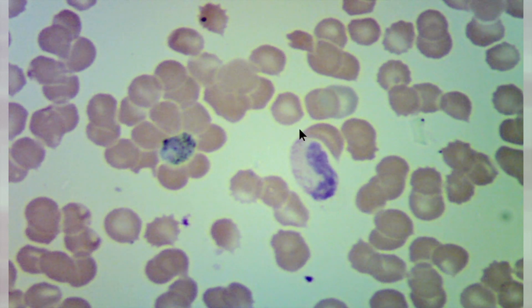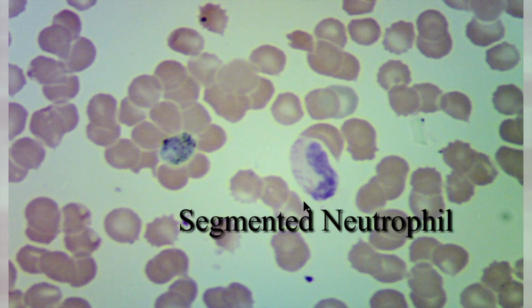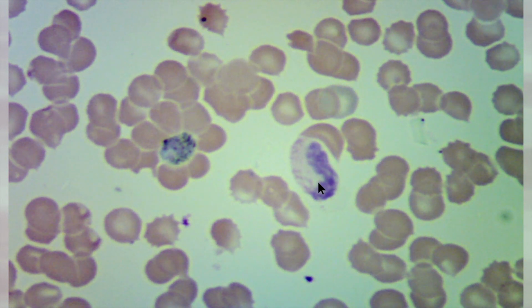There is a neutrophil here, appears to be normal. It is a segmented neutrophil, even though at the first glance it appears to be a band. However, there is a fold in here, and I do believe this is a segmented neutrophil. The granulation of the cytoplasm also confirms that hypothesis. But the most important finding of this slide right now is the presence of this structure.